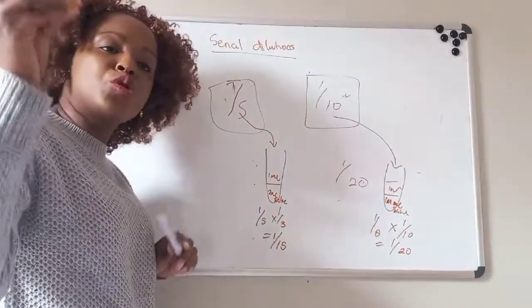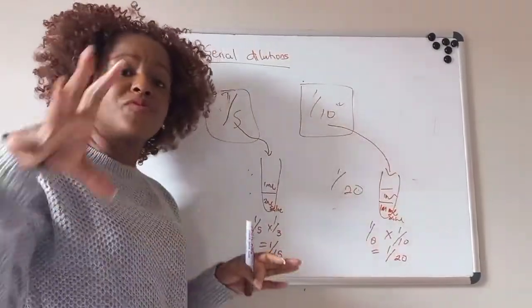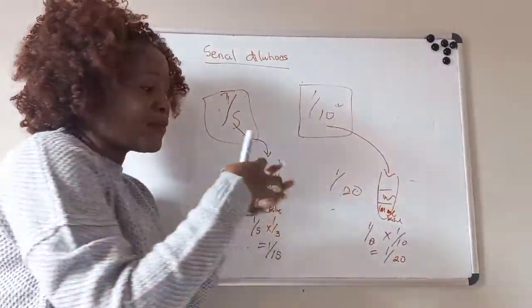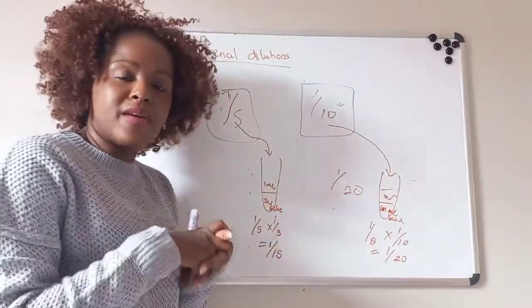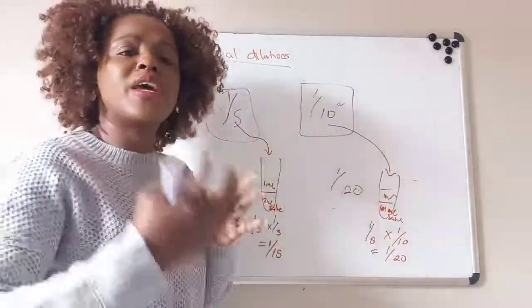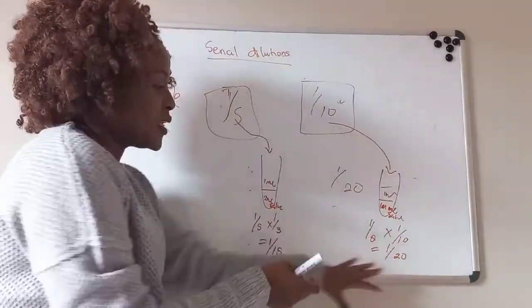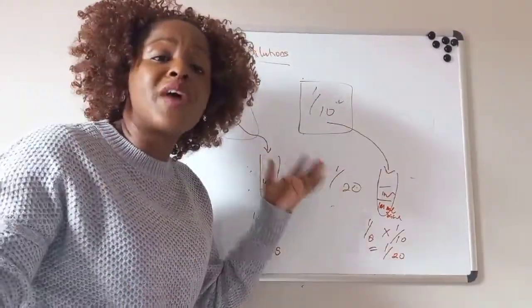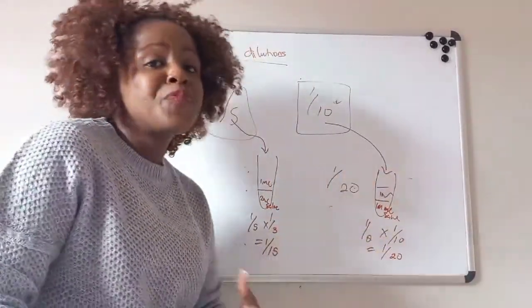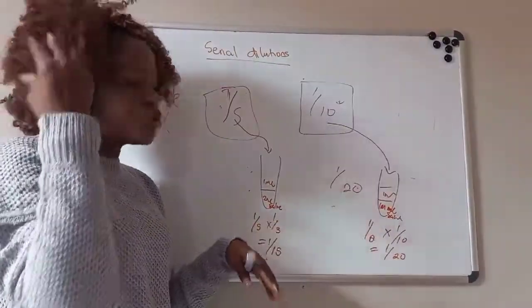And then you're going to calculate the percentage difference, like I showed you in a previous video. If the percentage difference falls under the total allowable error for amikacin, then it means you can release those results, and maybe you can release this 1 in 15 and enter your 1 in 20 as a check value. Instead of asking for a repeat, you manage to give out a result. That's what you will do.